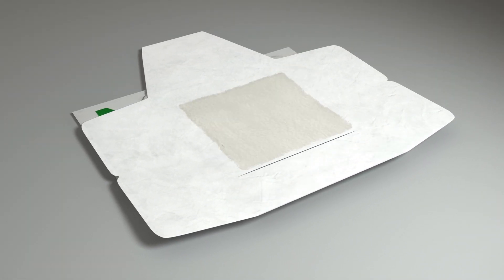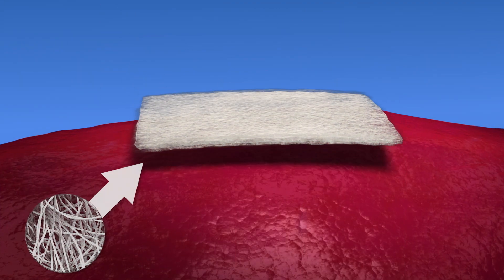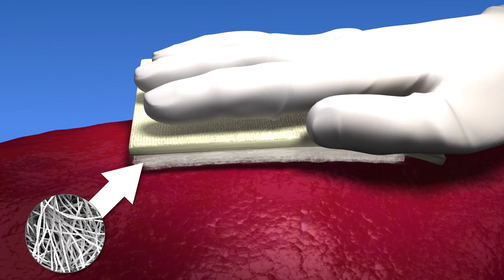Surgicel products are ready to use right out of the package. When applied to the bleeding site, Surgicel provides a physical barrier to blood loss.